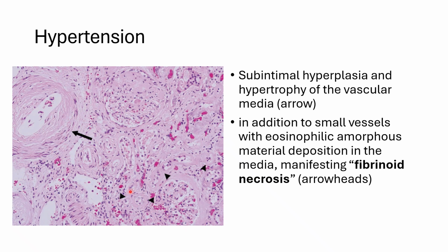There will be damage to the vasculature, due to which the substances inside the vasculature leak out into the interstitium, causing the inflammatory infiltrate as in here. So fibrinoid necrosis is a microscopic tissue injury to small blood vessels where cellular components leak and accumulate, causing a glassy pink staining appearance on the slides. It is a result of autoimmune conditions like SLE, systemic lupus erythematosus, or sometimes hypertension.